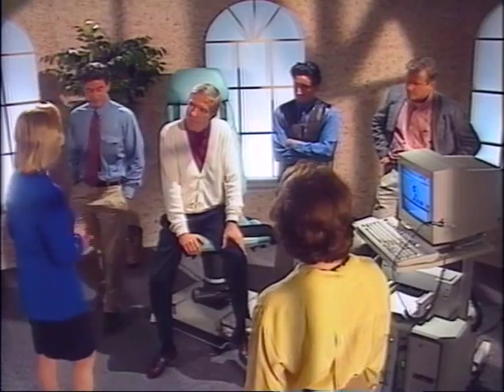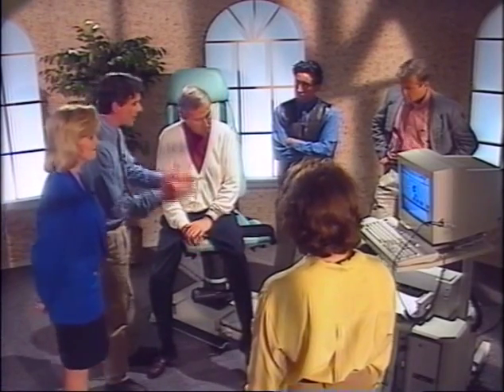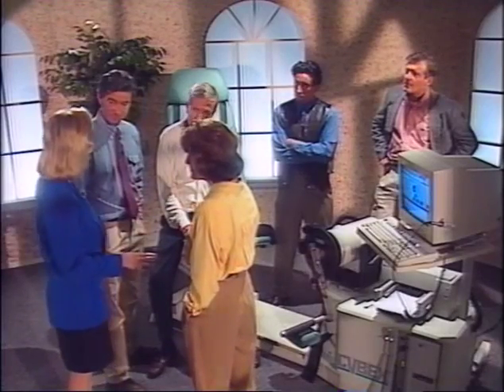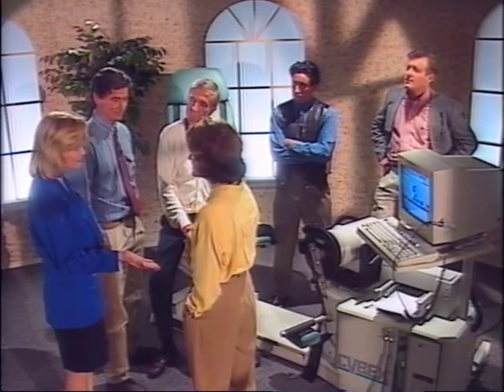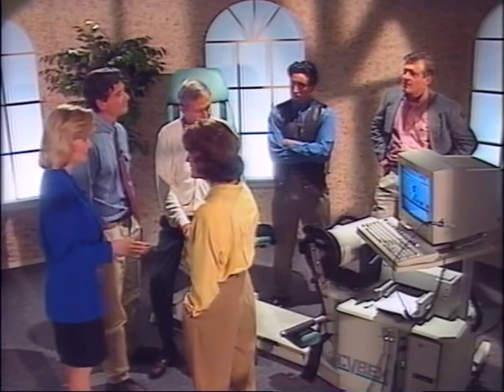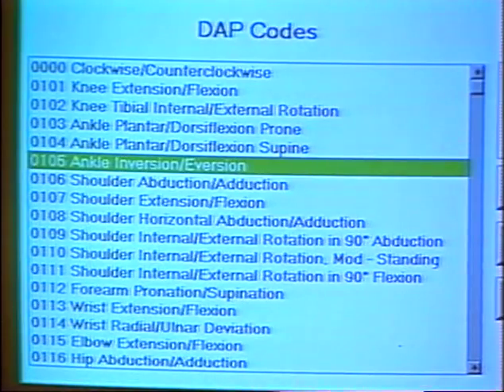My facility is pretty tight for space. What is NORM's footprint? Only 28 square feet. This entire system will fit into almost any size facility. How about the price? The system is competitively priced and can be purchased through the CYBEX leasing program. To answer your question, NORM is affordable for any practice. But what about the setup patterns? NORM has a total of 23 patient setup patterns. Well, in my practice, I mostly see patients with sports-related injuries.